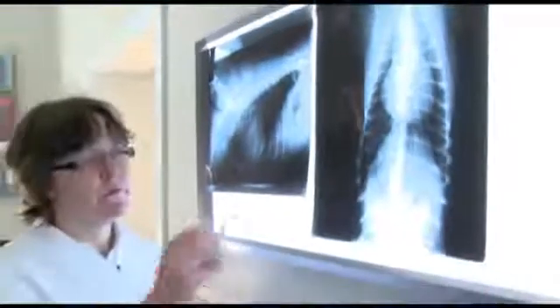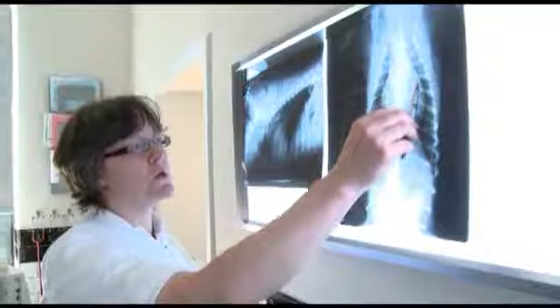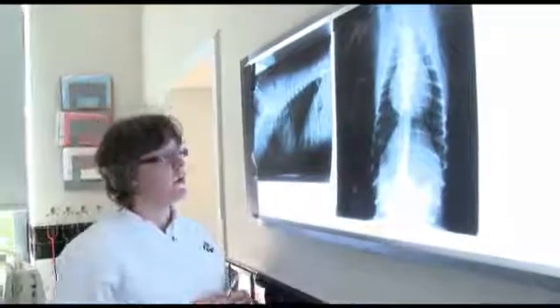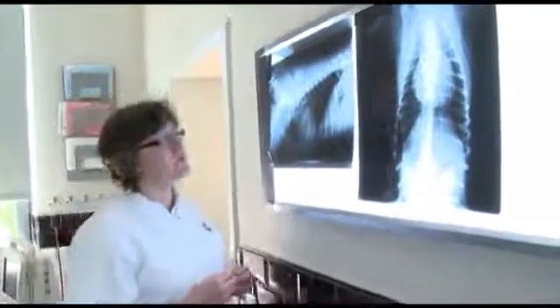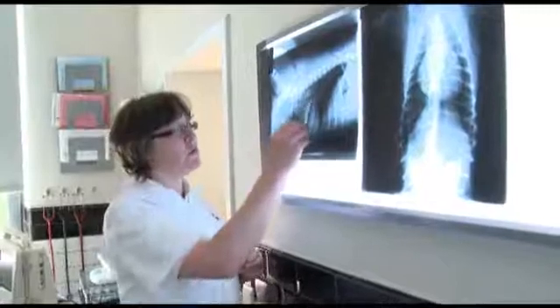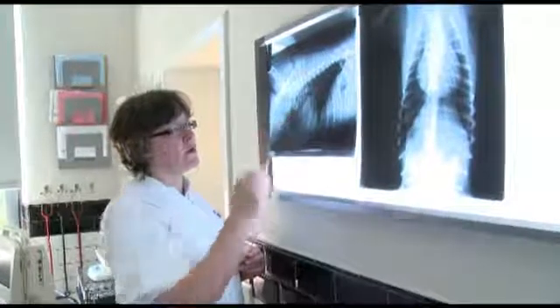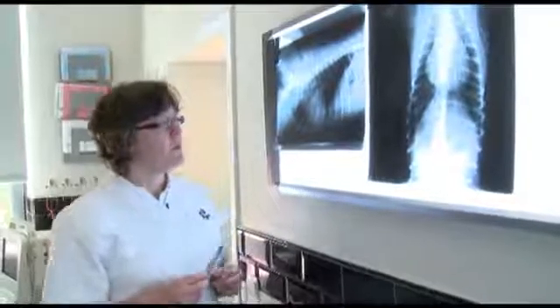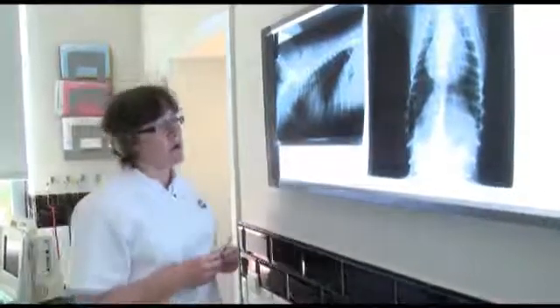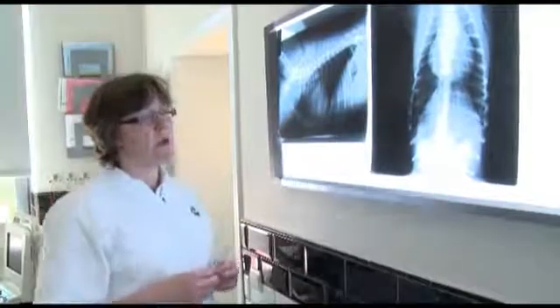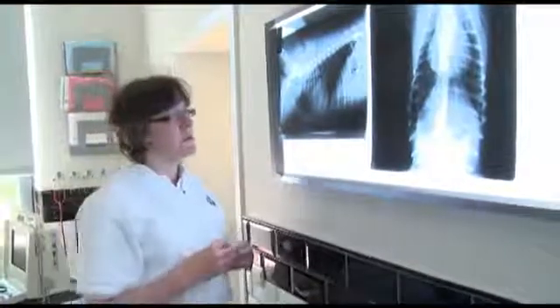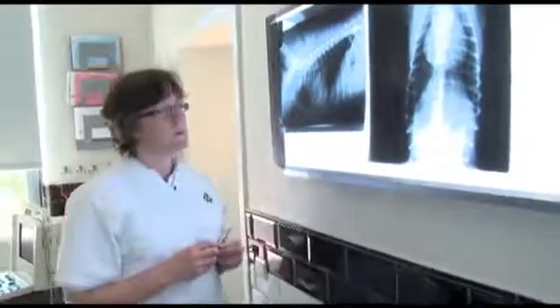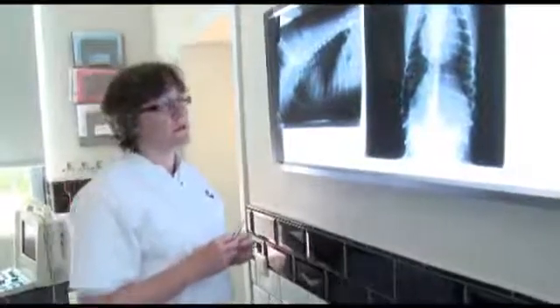A prominent pulmonary artery or pulmonary artery bulge can often be visualized in the 1 to 2 o'clock position on the dorsal ventral radiograph and occasionally, but often less visible, just under the bifurcation of the trachea on the lateral radiograph. This can be a sign of pulmonary hypertension, can be seen as well as a post-stenotic dilatation with severe pulmonary stenosis and some other conditions.